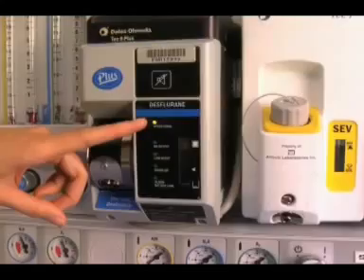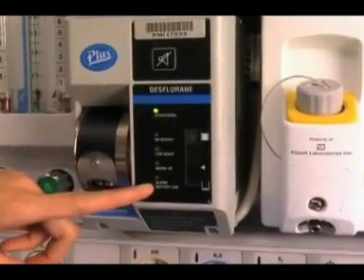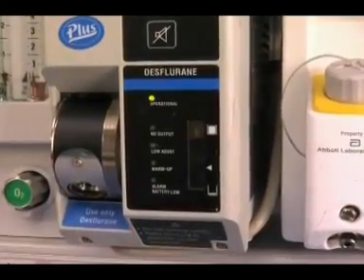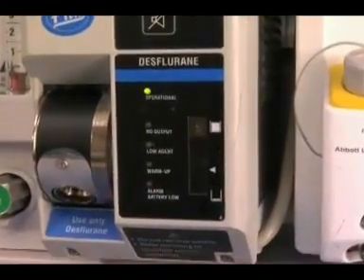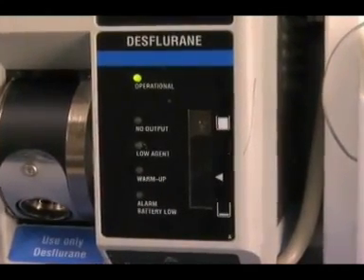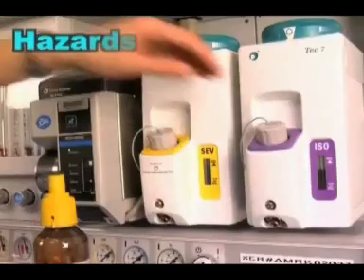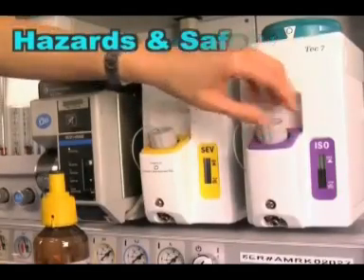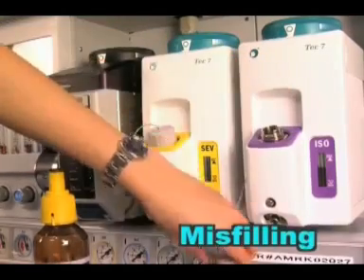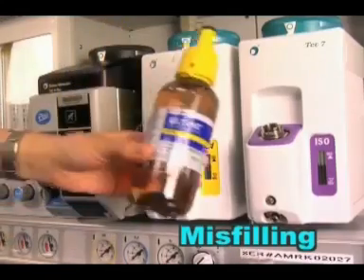Unlike other tec vaporizers, Desflurane models electronically control the temperature and pressure inside the vaporizer. Furthermore, the wick system is not utilized because Desflurane saturates carrier gas quickly. One very unique feature of the Desflurane vaporizer is the visual and audible alarm that signals the user when the vaporizing condition is not optimal or when agent in the vaporizer is almost empty.